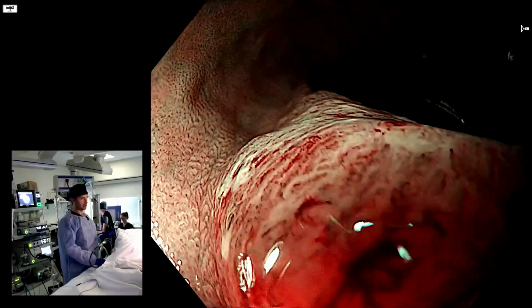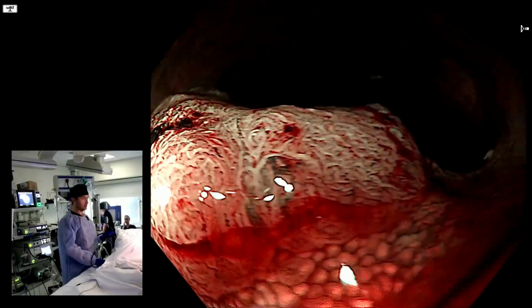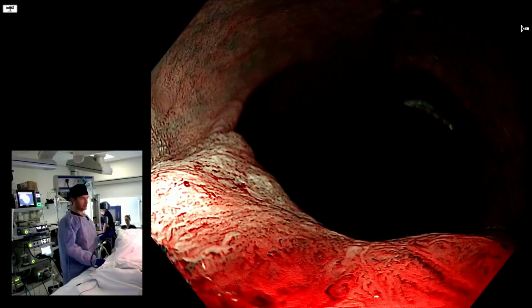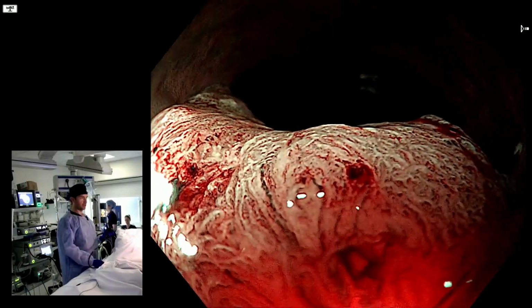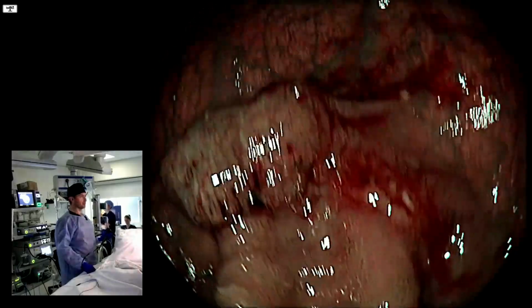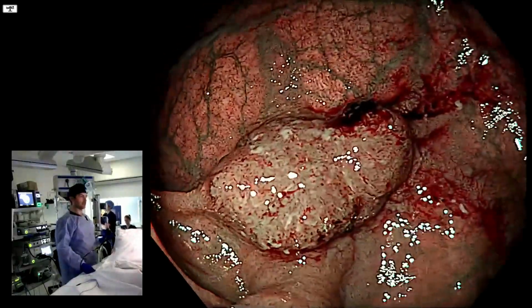because actually the last part of blink assessment is look closer. And the look closer can be done by you, but also must be done by the person performing the endoscopic resection in the end, potentially. And that person needs to make an assessment of the vascular pattern and what type of endoscopic resection to offer the patient. So there you go, and now I've traumatized the surface, Peter Yan, so it wasn't just you.